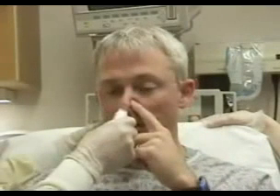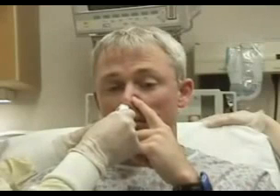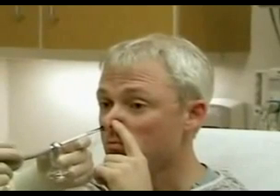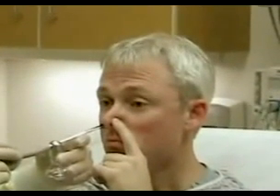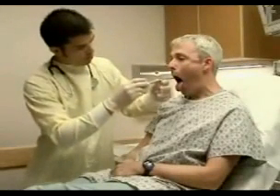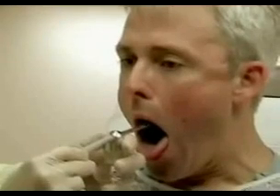Have the patient breathe in through each nostril to assess which side is more patent. Pre-medicate the nasal cavity with a vasoconstrictant spray, such as phenylephrine or oxymetazoline. Anesthetize the nasal cavity with a topical anesthetic, such as 4% lidocaine or topical lidocaine jelly. The posterior oropharynx should also be anesthetized with a lidocaine or topical benzocaine spray.